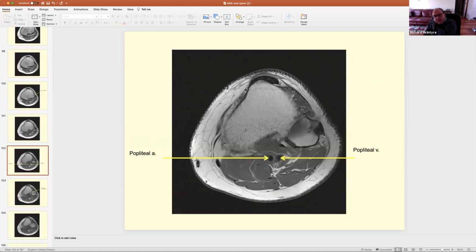Vein and artery. To differentiate those two is a little bit difficult at this stage, but you can see how the artery is more compact, round, and it's got a muscular wall, whereas the vein is a little bit squashy. Okay, and maybe you've done ultrasound, and you know that when they do ultrasound, they push with their probe on the vessel, and the vein compresses, whereas the artery, its muscular wall, stays quite tight. Okay, so that's a good lesson all the way through the body. The arteries are quite tight, the veins can compress, a little less muscle in their walls.